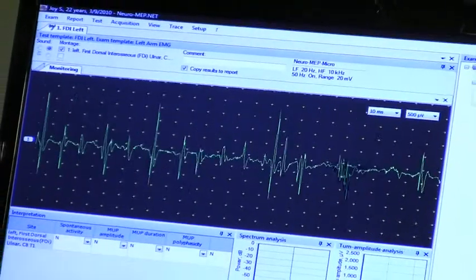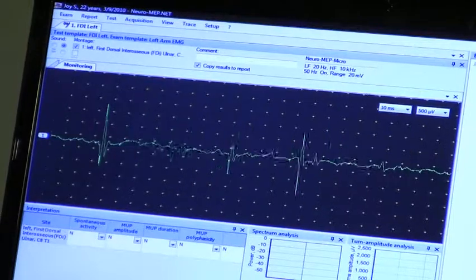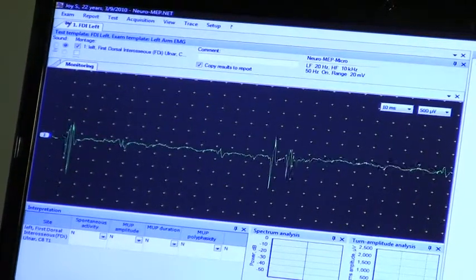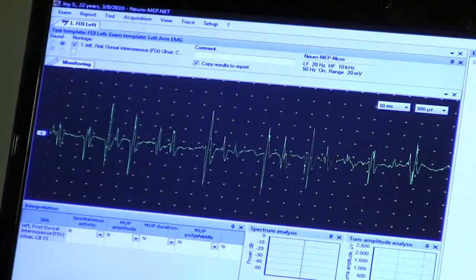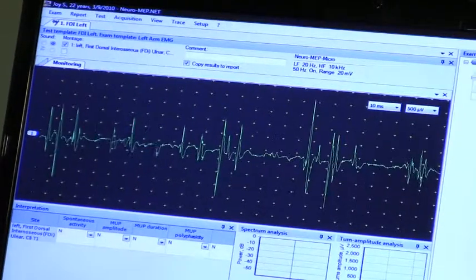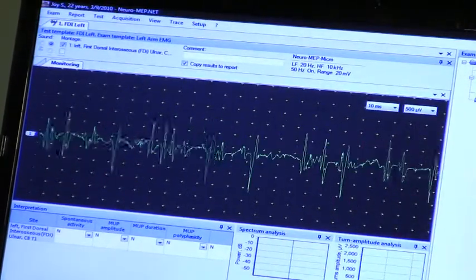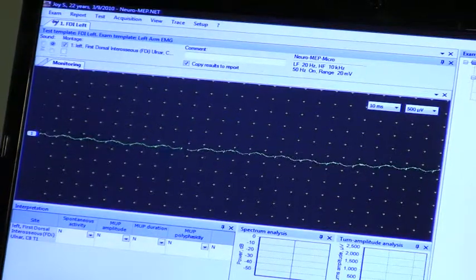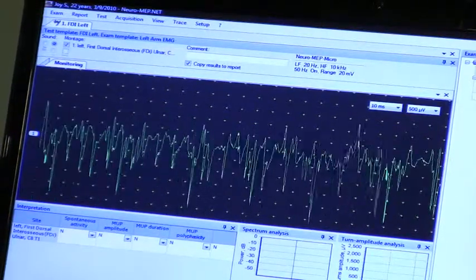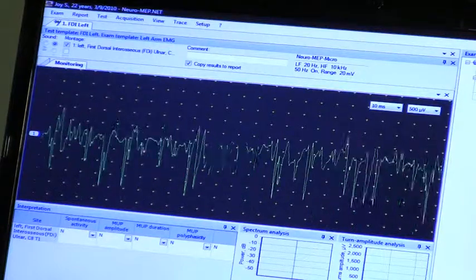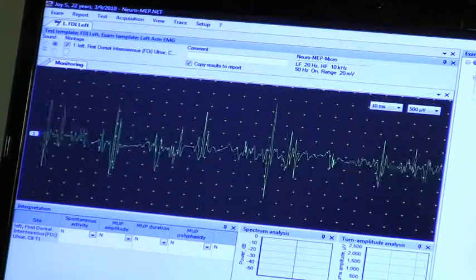And this is at moderate activation. Raise it a bit less, a bit less. Now I see one or two here, three. Raise it some more. Raise it some more. Okay. And now raise it up all the way. And now this is called full interference pattern. That means that the muscle is fully activated.